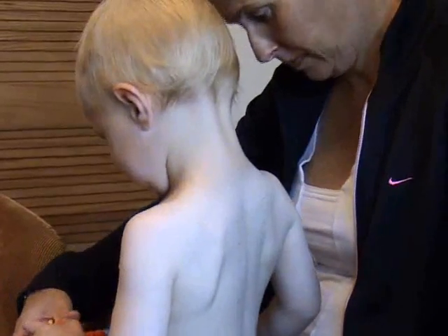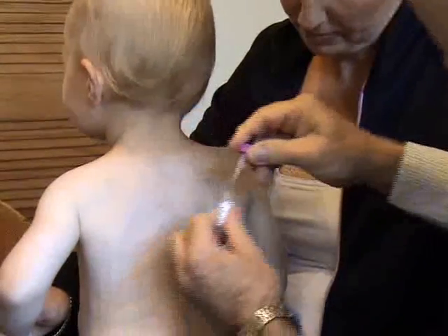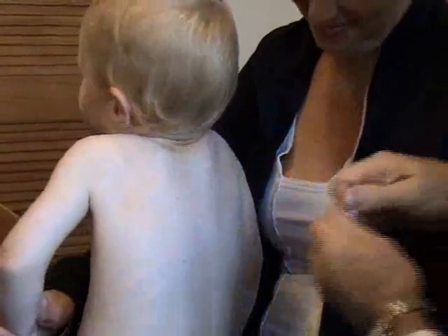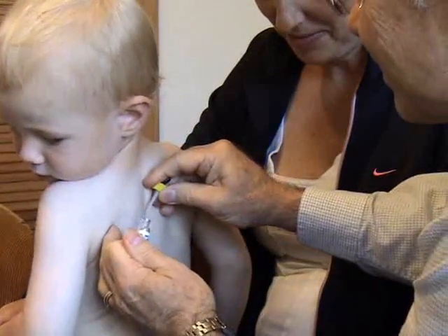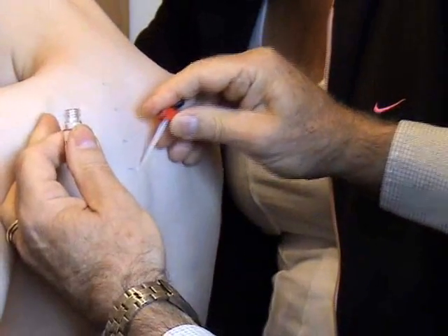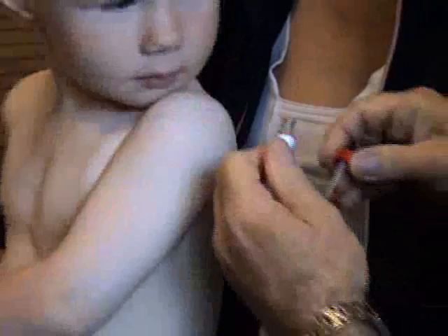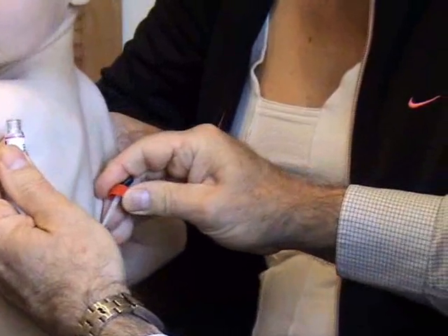And now we're going to do some little drops on your back. This is the control. Good boy Josh. Next one we're going to do dust mite. Fantastic. Next, egg. Beautiful. And milk. And peanut. That's good. Beautiful.